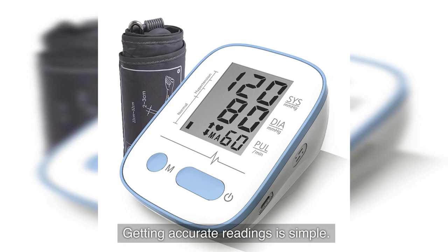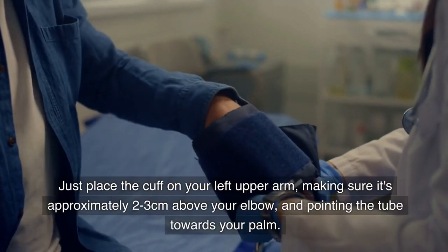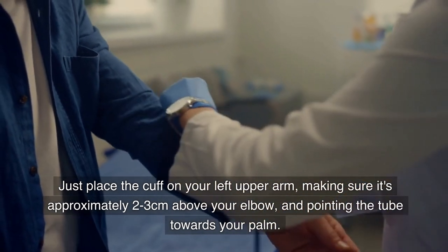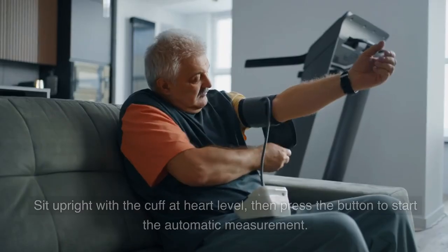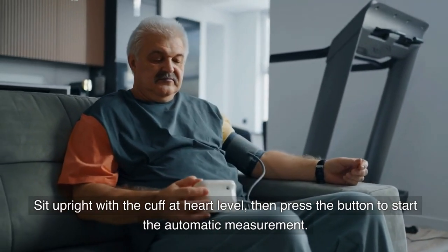Getting accurate readings is simple. Just place the cuff on your left upper arm, making sure it's approximately two to three centimeters above your elbow and pointing the tube towards your palm. Sit upright with the cuff at heart level, then press the button to start the automatic measurement.